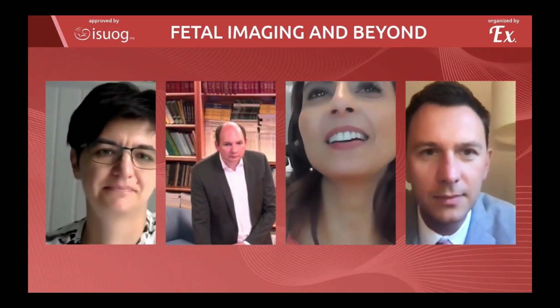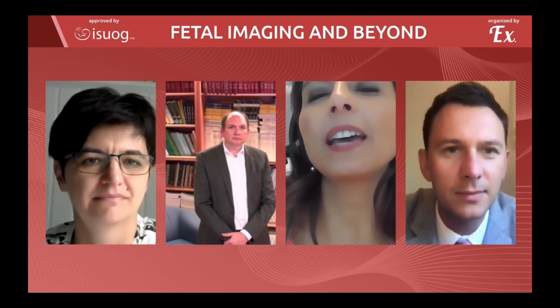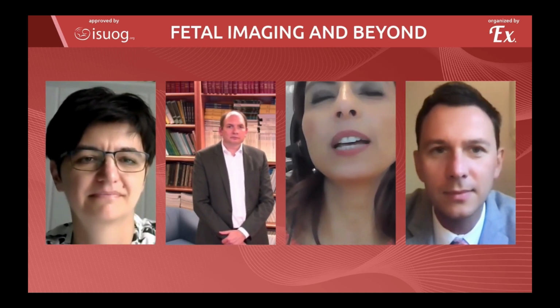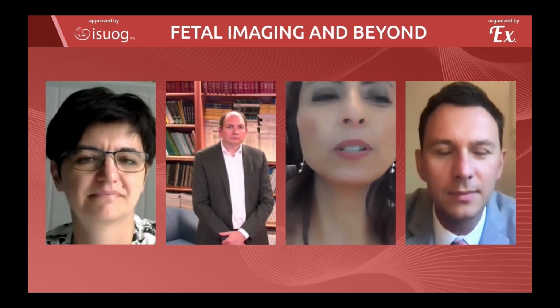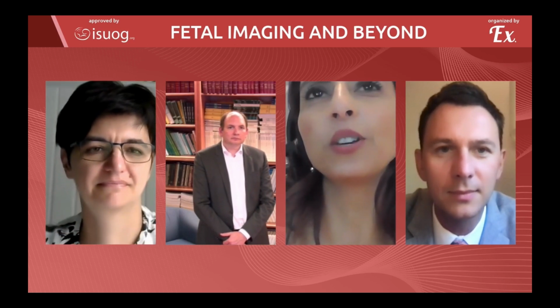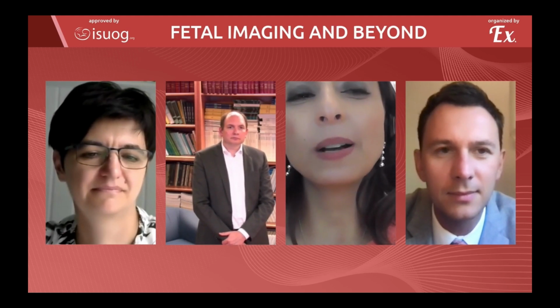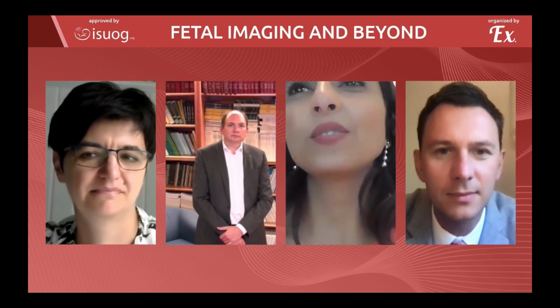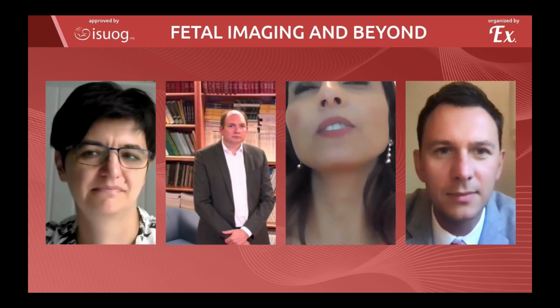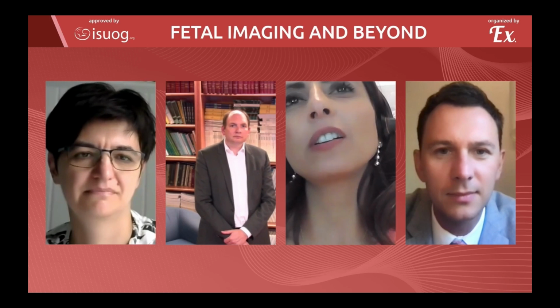That was amazing. Thank you so much, Gregor. Very crystal clear, very important key messages, and also highlighting some of the things that we could see on MRI and how they correlate with ultrasound, particularly with the new modalities. That was wonderful. Thank you. One thing that I find really interesting is the last couple of slides of your talk about the COVID and the fact that these fetuses of mothers who had COVID actually had evidence of intracranial hemorrhage.